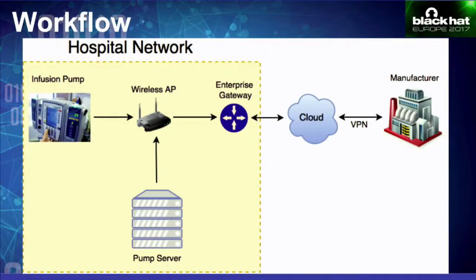Again, I've tried to create a workflow. The infusion pump was connected to the hospital infrastructure using wireless. It constantly spoke with the pump server. The pump server is something that stores and caters configuration to an infusion pump: your patient name, the drug for that patient, how much dosage, at what time, and so on and so forth. And manufacturers usually have access to these devices through the hospitals' VPN, so they can connect remotely and troubleshoot. Like I mentioned, most of these devices are heavily maintained by manufacturers' own technicians and not by the hospital staff.